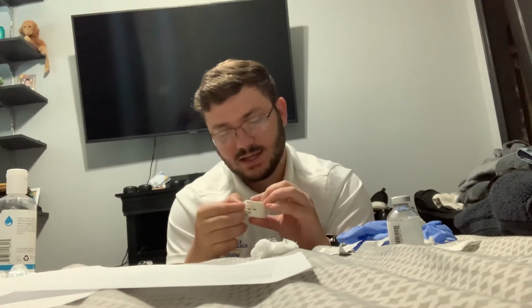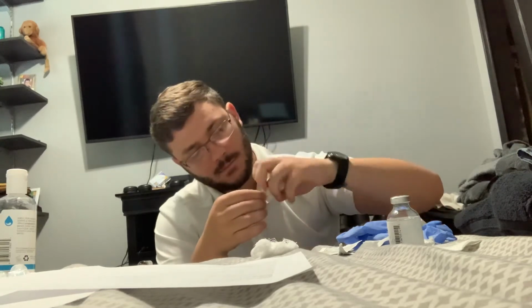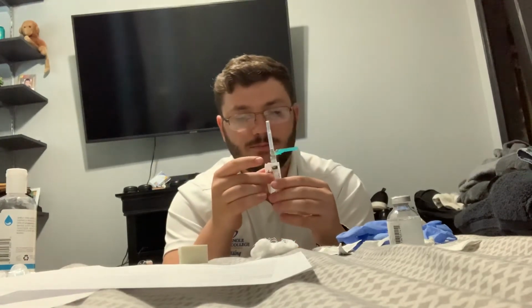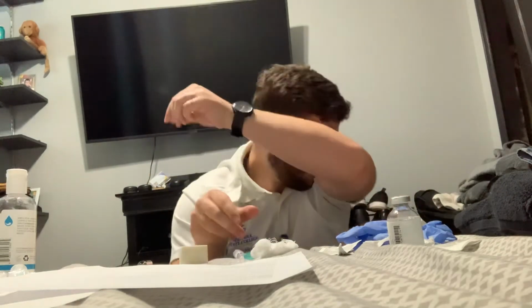Always the hardest part is not to rip it. Okay, I'm going to stick this onto the label. Okay, so that is on there. So now, re-entering the room with all the medication that I have, I'm going to foam in again.